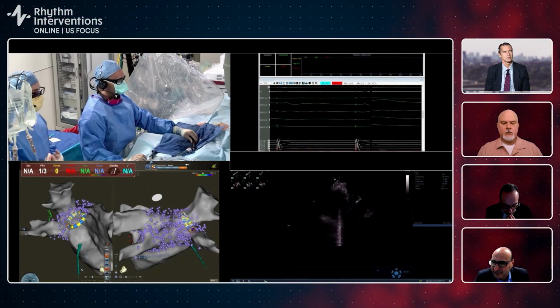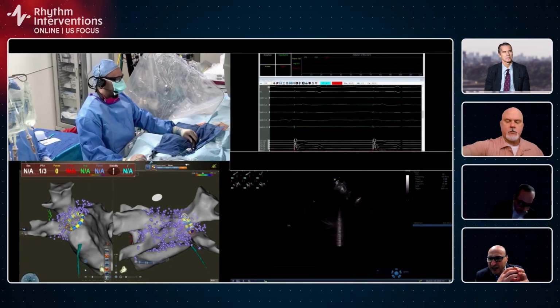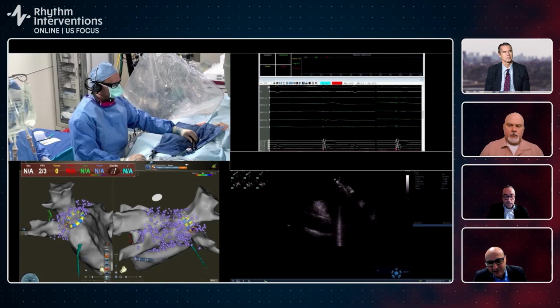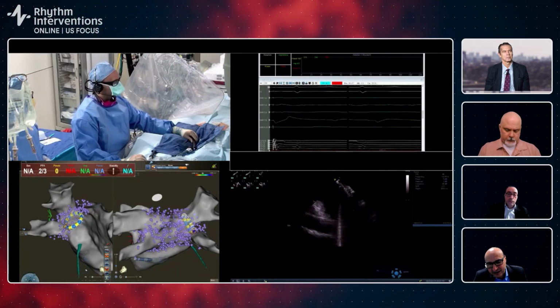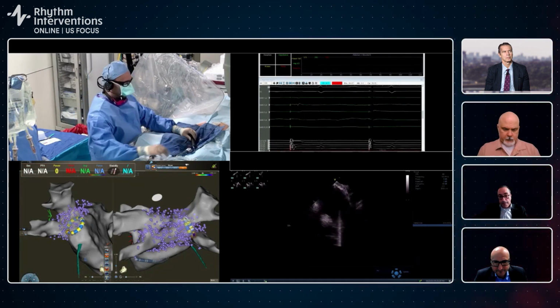And I'd like to ablate that area way beyond the carina. So this catheter, a hole as a circle, you can put it across, as you see here, across that antrum of the right vein, and you can ablate it. And I think this area is important, and I do it a lot, and it is easy to do with this catheter.